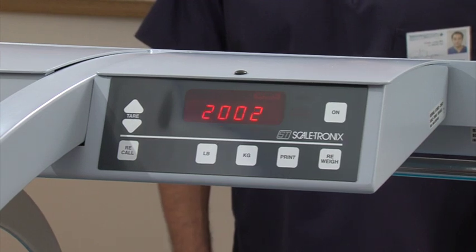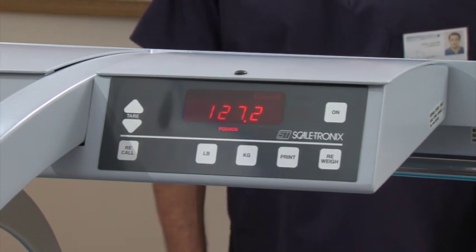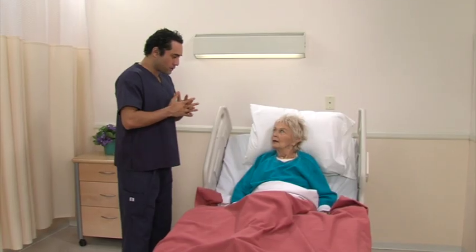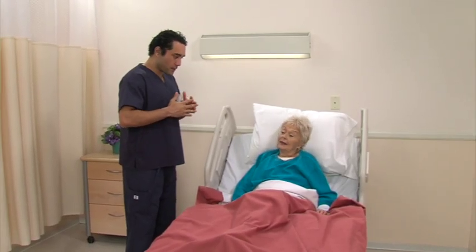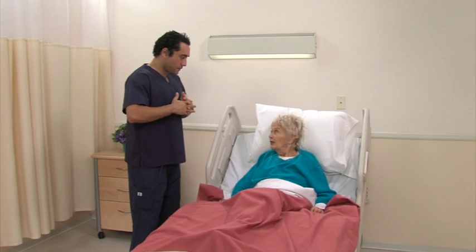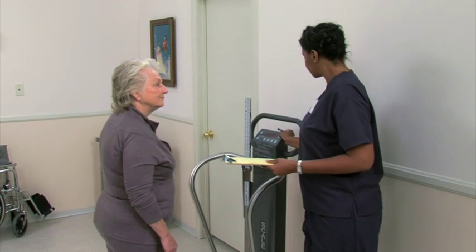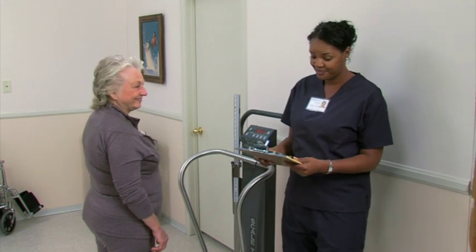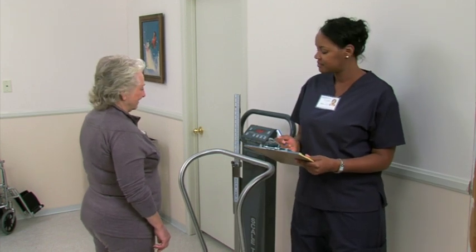Although measurement of body weight may seem routine, accuracy is of utmost importance since medical and nursing decisions may be based on these measurements. This program will demonstrate measuring weight with different types of scales that are available for use depending on the condition of the individual.